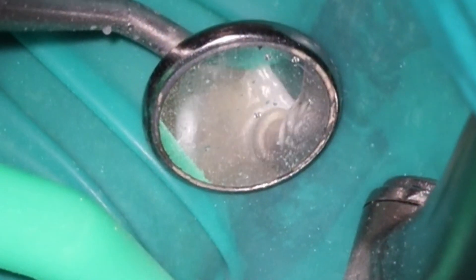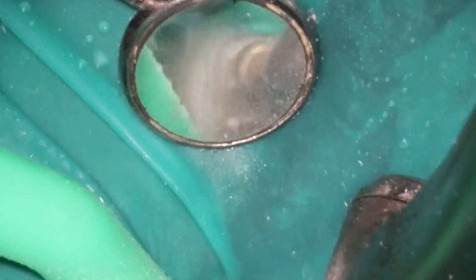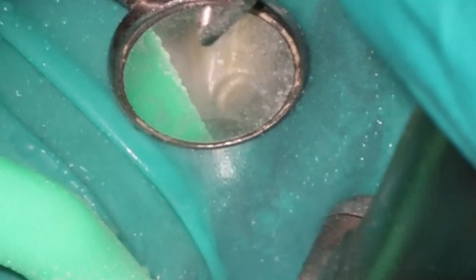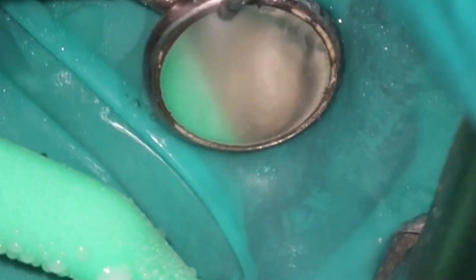Starting off, take it out of the bite — super important here because you've already cracked the tooth. She's already had some trauma to the area and we don't want it to crack further. In a case like this, for sure it needs a crown. That's why this tooth died in the first place. So take the tooth out of the bite as your first step.